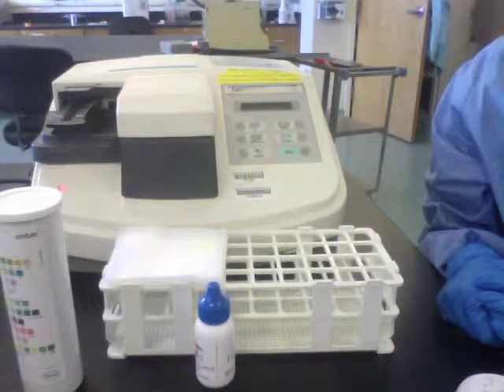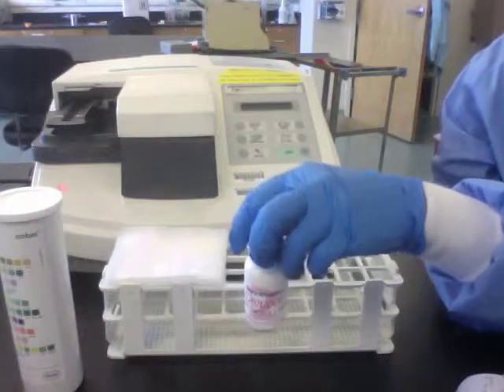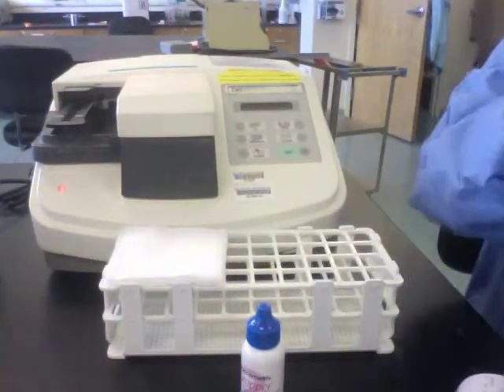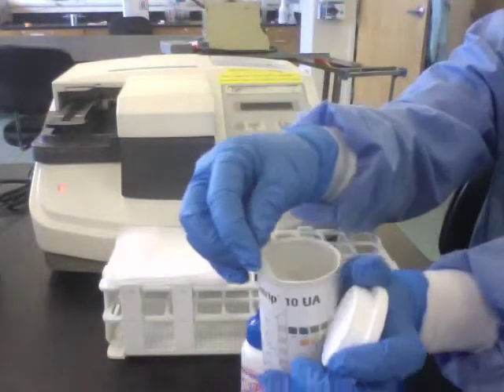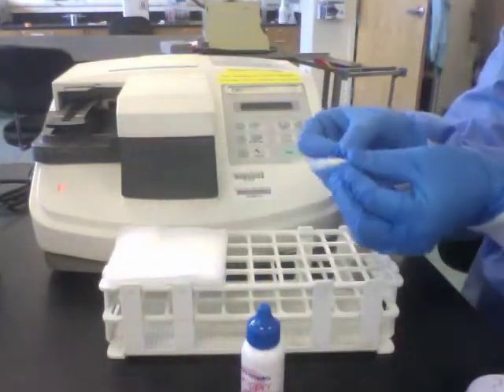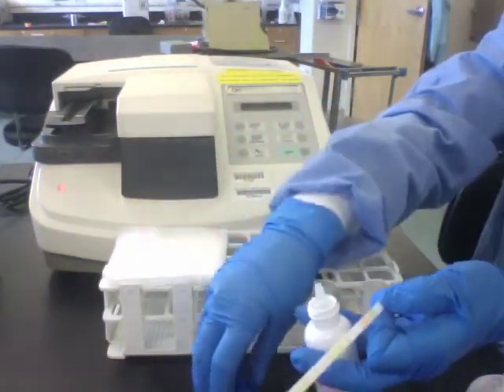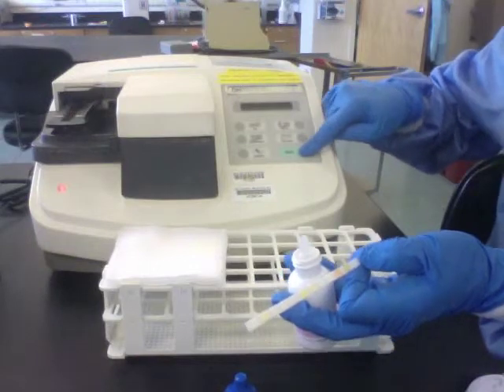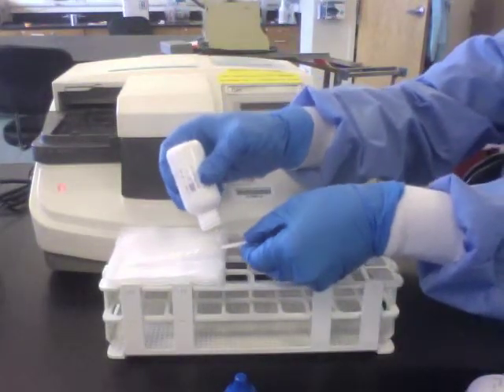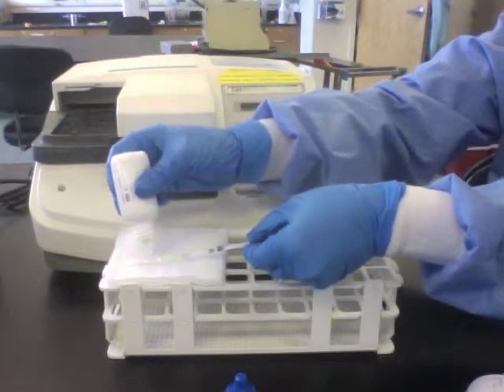Quality control on the Criterion Analyzer will most likely be from a dropper bottle. To perform a test with a dropper bottle, simply prepare your strip, prepare the QC, press start, and add your QC to your chem strip.